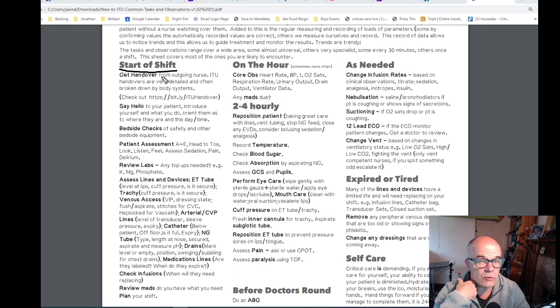Check the venous access. So like I say, the central line. They may well have peripheral access as well. So they're going to have one or more venflons, for example. You need to know how long those venflons have been in. If they've been in 3 or more days, then it may be that they need to come out. You need to assess them. Policy in most hospitals says 3 days and out they come. But to be honest with you, sometimes you're going to look at a venflon, it looks like it's working perfectly well. You need to assess each on its merit. That's my opinion. That's not necessarily going to be your policy.